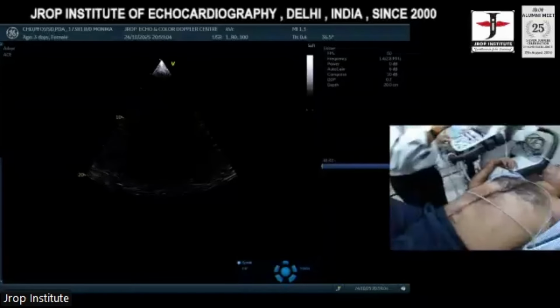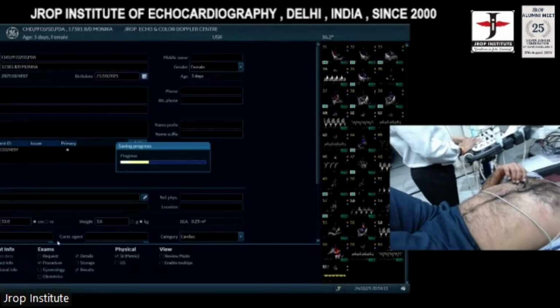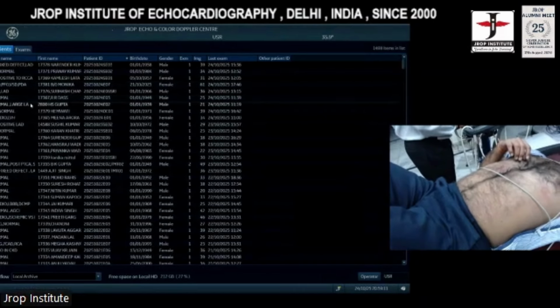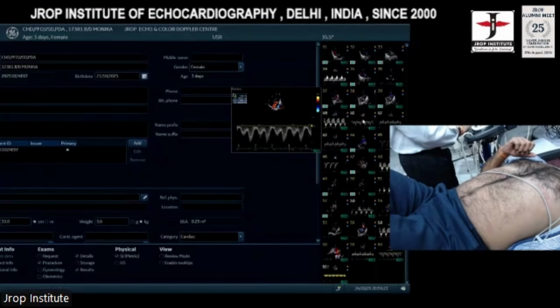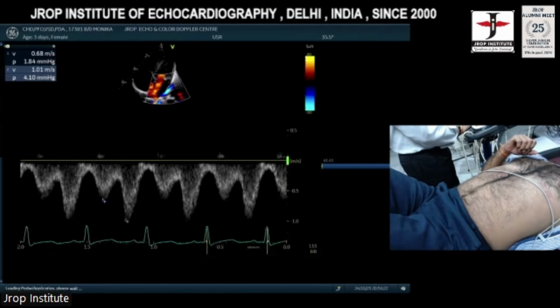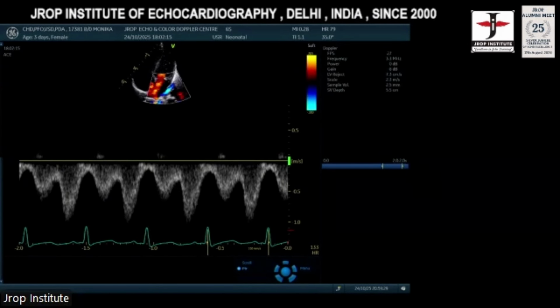Let me show you a recorded finding. I just did it today in the evening. Give me a second. Let me see if I can get rid of this ECG gating.